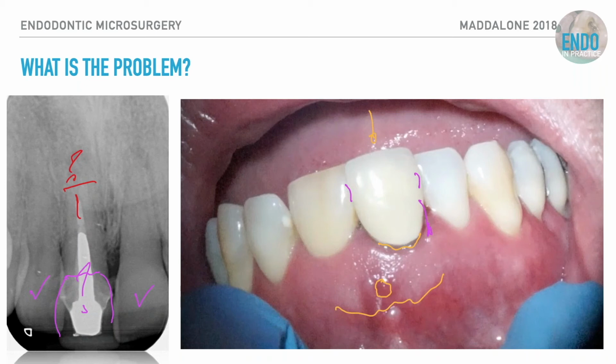lack of periradicular disease on the radiograph, a heavily restored tooth with a history of trauma, because certainly you can see there's pulp canal obliteration of the adjacent central incisor. A root fracture is by far and away your most obvious clinical diagnosis, and again, not an indication for periradicular surgery. And in fact, if you look at the literature, approximately 47% of root fractures can be identified pre-operatively before you actually go on and do the surgery, so that you're avoiding unnecessary surgery.